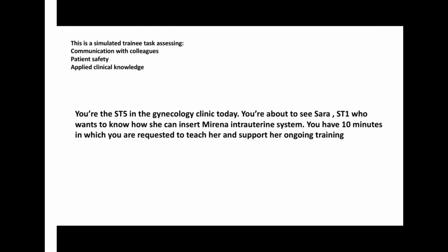There is also a specific card inside the package. You write the name of the patient, the date of insertion, and the date of removal, because the patient may forget the date of insertion. She has to keep this card for her records. So you write, sign it, and give it to the patient.